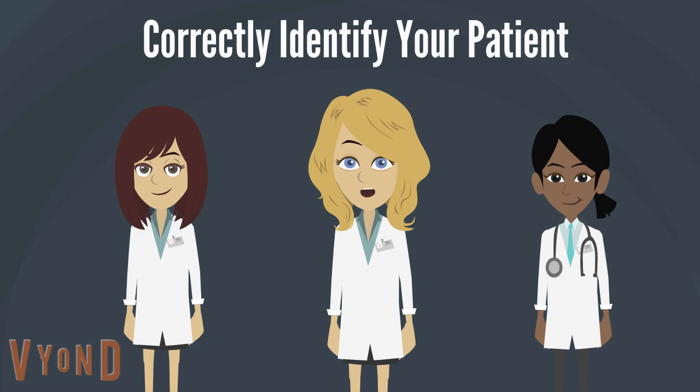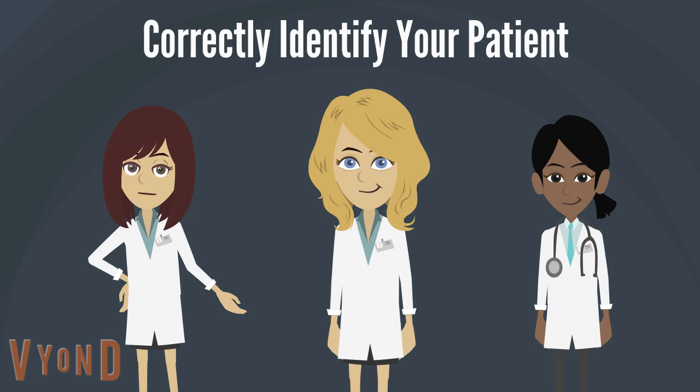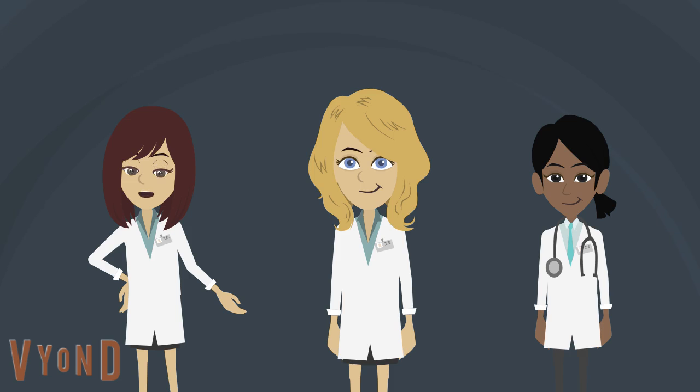Correctly identifying the patient for the pre-transfusion sample is an easy procedure that significantly lowers the risk of a wrong blood episode, and therefore reduces the risk of a potentially fatal outcome for transfusion patients. This is why there are strict guidelines in place when taking blood from any patient, and they should be closely followed by all medical professionals.